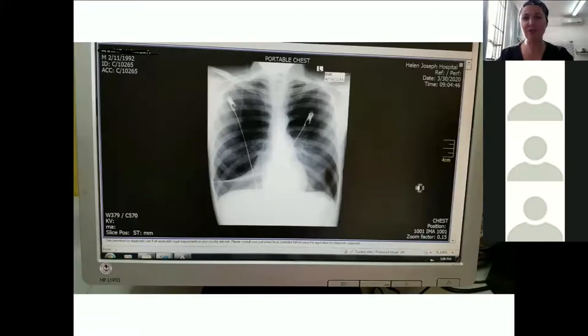And it's actually really interesting. If you have a look on the left-hand side, it definitely looks like you've got some infiltrates down in what would be the right lower zones. And can you see that quite bright white line? That looks like you've got some fibrosis that's kind of holding that part of the lung through to the side wall. But wait, this is quite exciting.